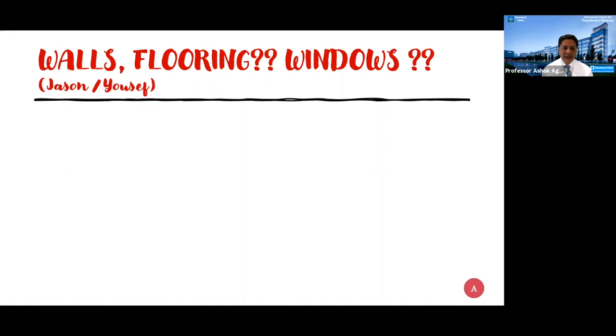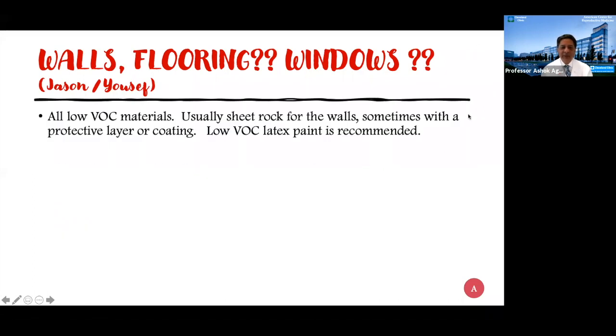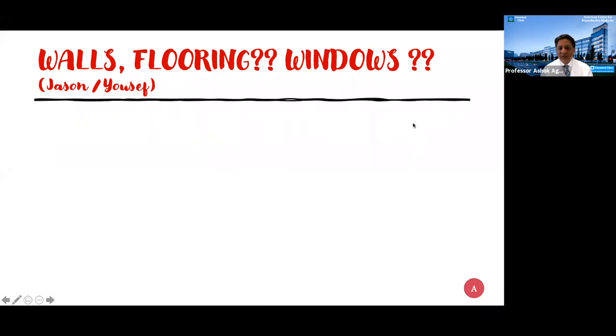So now the next is regarding the IVF lab in terms of the walls, the flooring, the windows, the entire enchilada. I mean, how do we really decide what type of wall? Should we have something like marble, or should we have just a regular wall? What kind of flooring? Should it be Italian marble or something very, very expensive? What kind of windows? So all of the infrastructure that goes into the building, should it be very expensive, very sophisticated, or should it be much more utilitarian and important for the variety of functions that will be carried out?